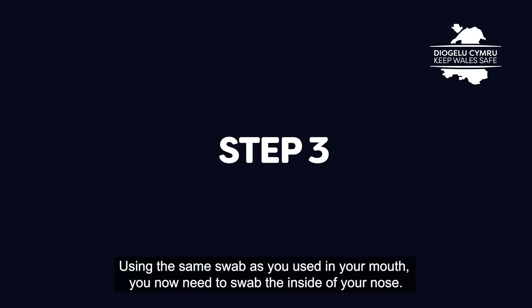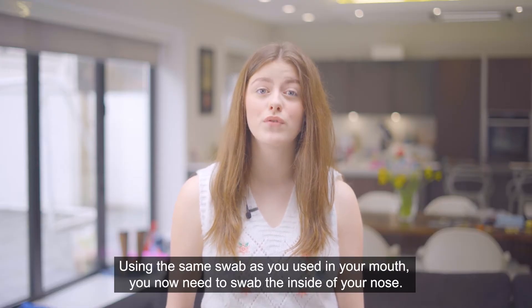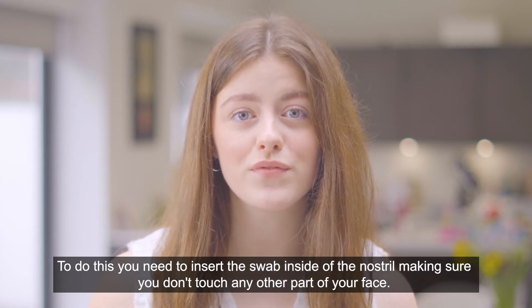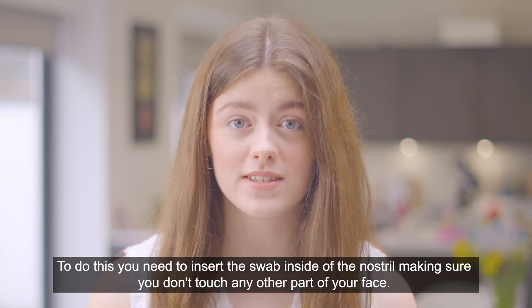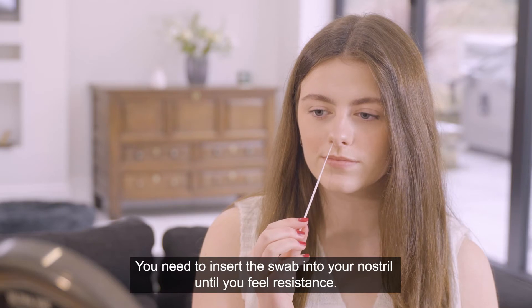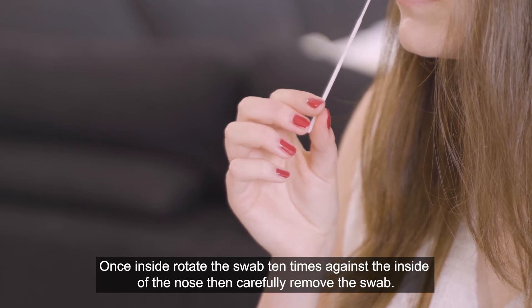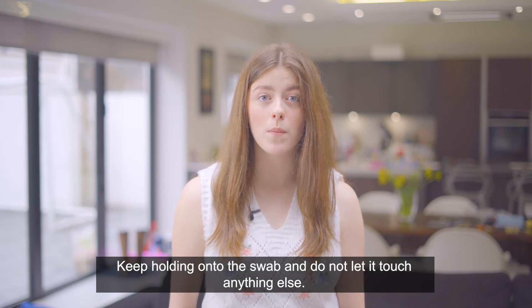Step 3: using the same swab as you used in your mouth, you now need to swab the inside of your nose. Insert the swab inside of the nostril, making sure you don't touch any other part of your face. You need to insert the swab into your nostril until you feel resistance. Once inside, rotate the swab ten times against the inside of the nose, then carefully remove the swab. Keep holding on to the swab and do not let it touch anything else.